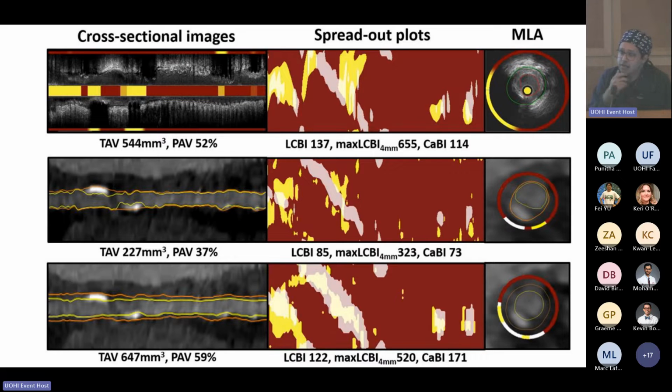Yeah, I think that's a very interesting and exciting point, actually, because the aorta and carotids are probably much better. There's less movement. And I suspect you're right. You'll pick up vulnerable patients, which may well correlate to vulnerable events. And I think that is probably where it'll end up going, because I just think the coronary movement is too much. Just doing a little bit of this in my study, certainly for PET, the movement is probably why the second study wasn't as good, their motion correction may not have been as good as the Edinburgh study earlier for the sodium fluoride. But the big hurdle is how do you manage the motion of the coronaries to get the imaging? It's interesting. Or PET imaging anyways.